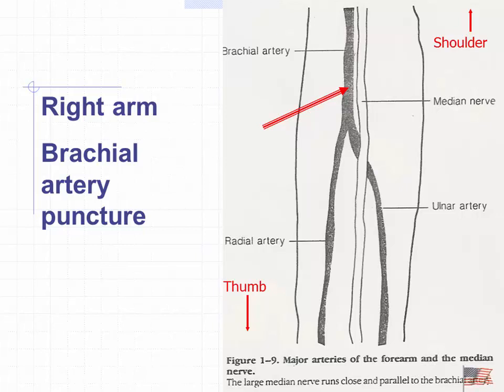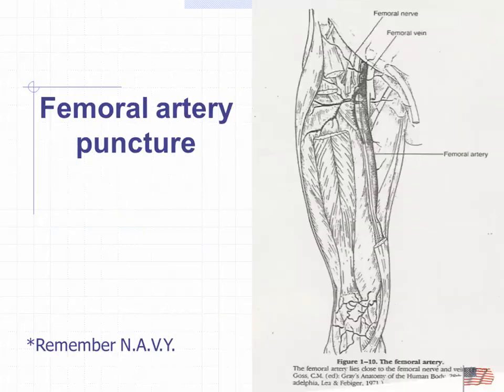And the third reason is damage to the arm secondary to our arterial blood gas puncture. And again, the presence of damage does not necessarily mean negligent performance was present. It just means that a bad outcome happened. If you don't follow the proper protocol, different story. Okay, and that's where we want to make sure that you're doing things correctly.